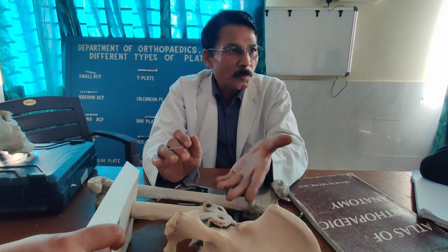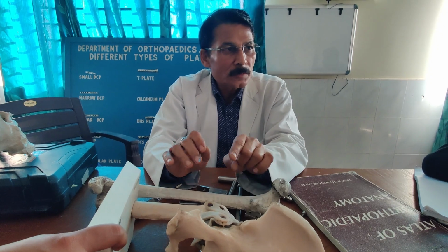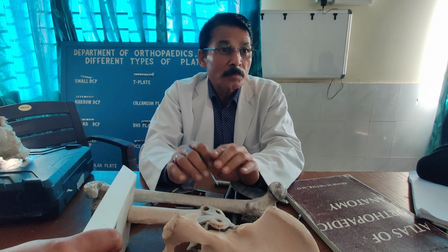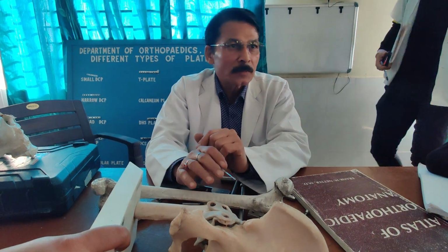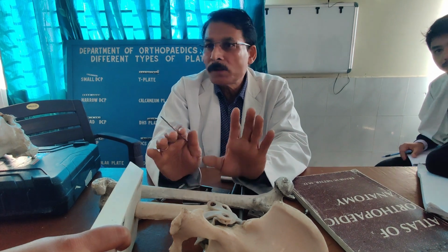Otherwise somebody is supposed to support it, because this whole technique, whole process, is to be done in the reduced state. So you do not try to do the reduction after fixation, after application of the implants. It will be another disaster for you. So you maintain the reduction first. You can take the help of the K-wire also sometimes to maintain the reduction.